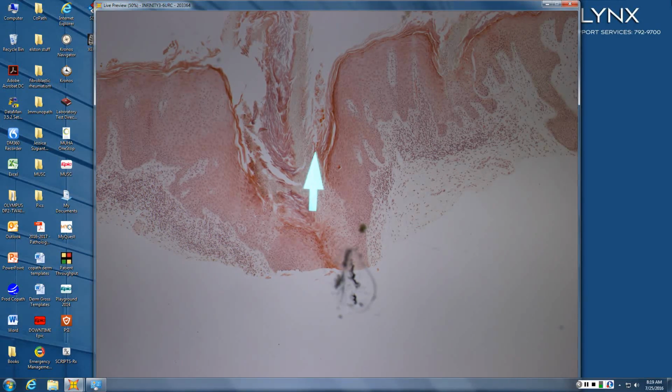Anyone want to jump in? So porokeratosis ptychotropica, P-T-Y-C-H-O, is on someone's backside.